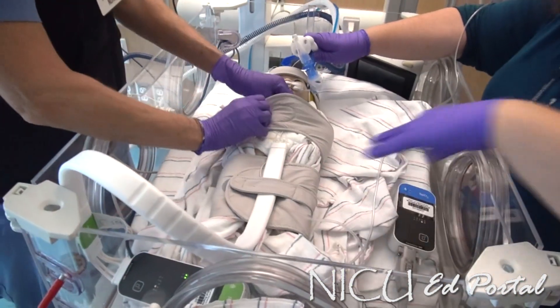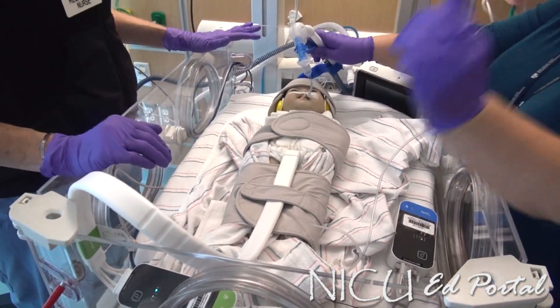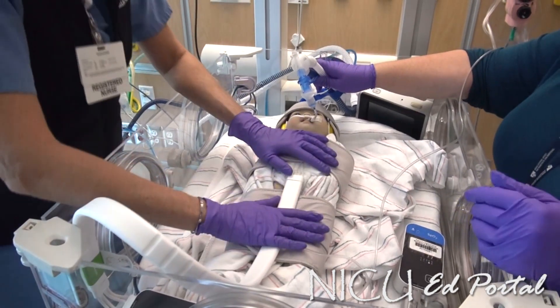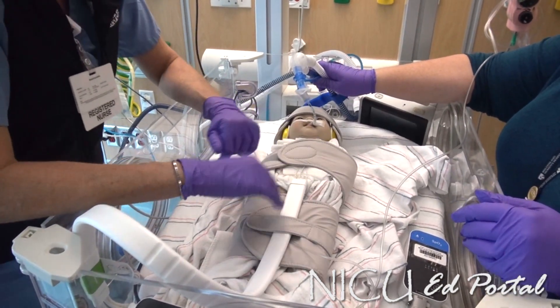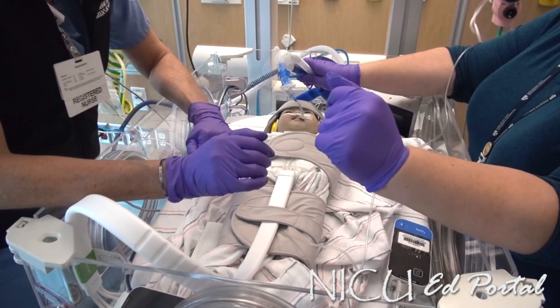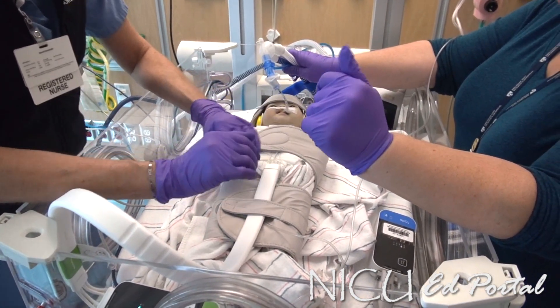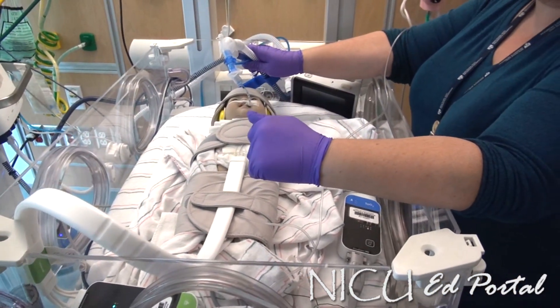Going across the chest again — okay, good. We're ready to roll into the suite. We checked him — no stickers on him or anything, we checked his back, everything was good. We changed his diaper. He's on the monitor. I think let's call Cindy to get him going.